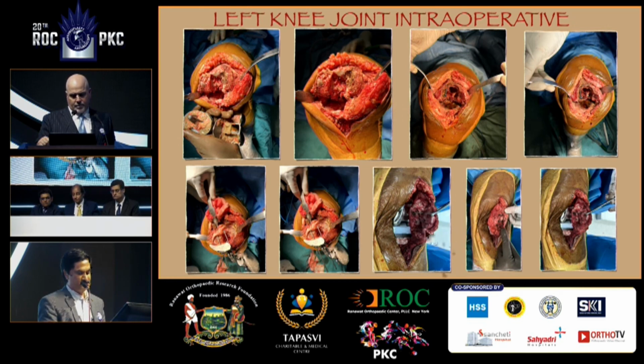And Arun Mullaji was asking about the patella. The patella was found fractured. It was fixed with wires. So a one-stage revision was done. Had the patella been resurfaced? No, it was fixed. The patella was fractured. Did you fracture it? No. It wasn't fractured on the x-ray; the x-ray showed that earlier it was fractured.